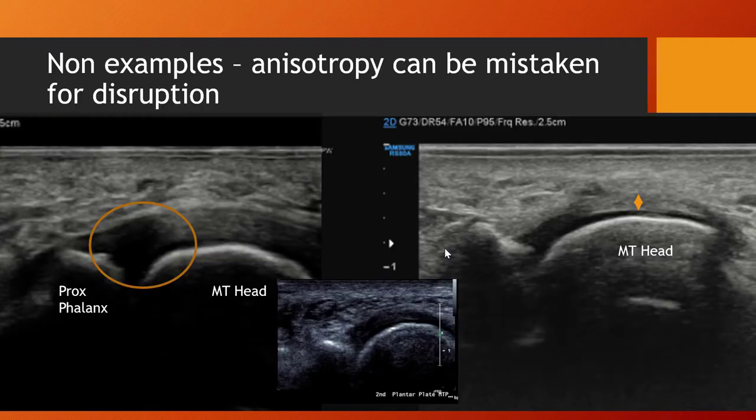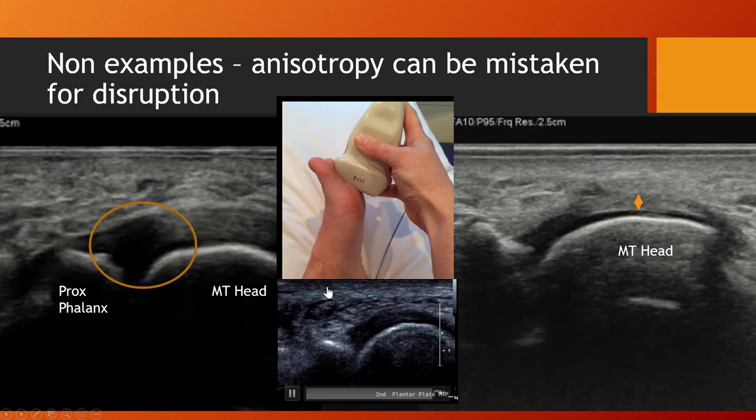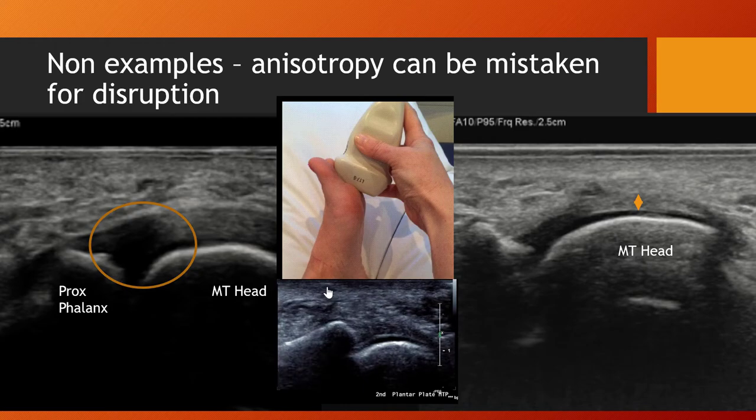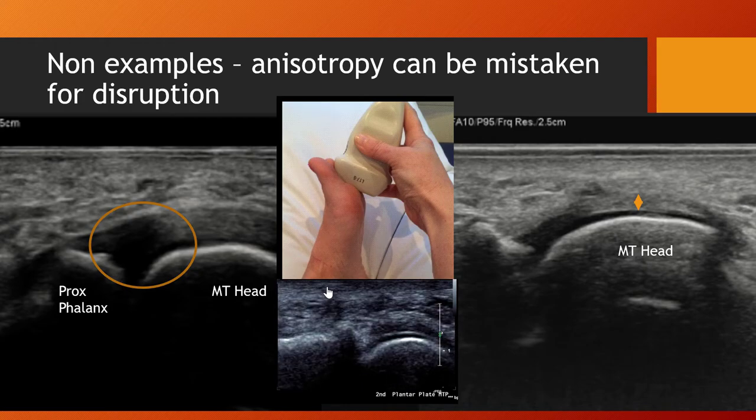So here's one for the wall of shame. It's an ultrasound contribution. If the plantar plate is not parallel with the top of the screen, then anisotropy can mimic a tear. So this poor quality longitudinal image doesn't show us the most critical portion of the plantar plate towards its insertion. It's not visible. Same here, we get good reflection over the metatarsal head, but our business end is not well visualized. So obviously the probe wasn't rocked onto its distal end, and perhaps this sonographer had someone belting down the door with a full bladder and they were just keen to get out the door.